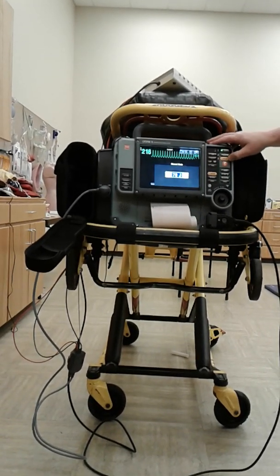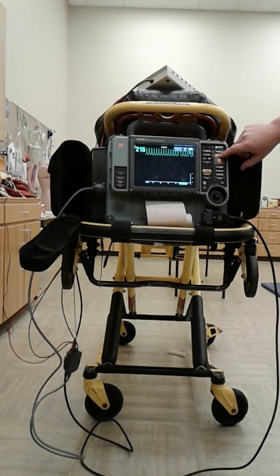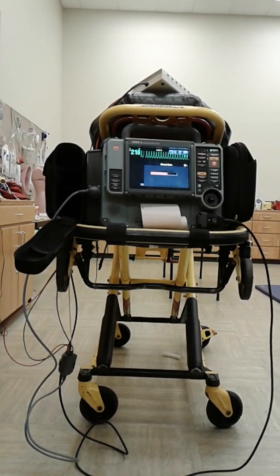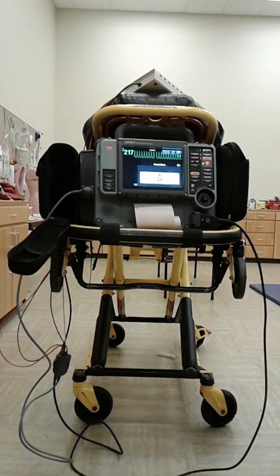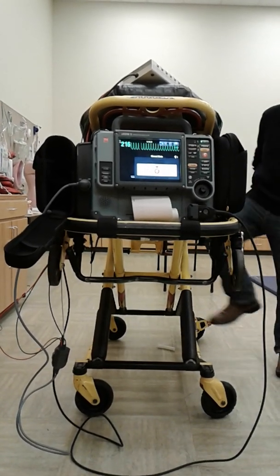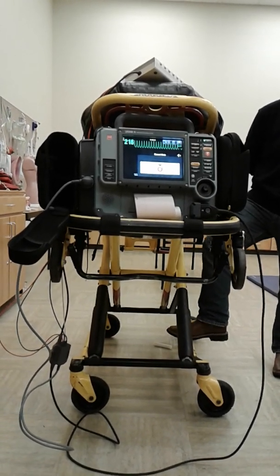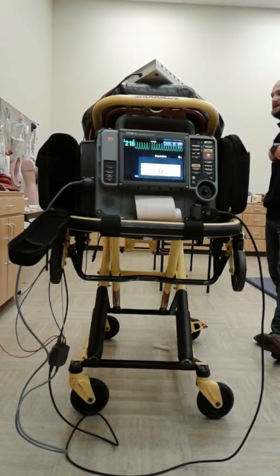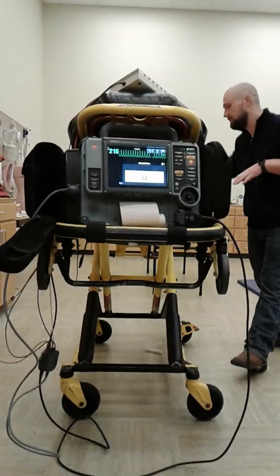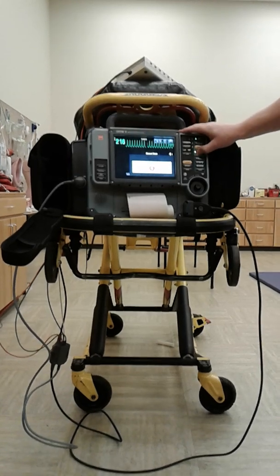All right, so that did work. So we'll juice them up there. We'll go to 100 with them. All right, charging. We are charging at 100. All right, you want to make sure your patient's clear, nothing's touching you, or you're not touching the patient, your partner's not touching the patient, you're not legged up on the stretcher like this right here. Same thing as when you defibrillate the patient. All right. I like to teach people, say, "I'm clear, you're clear, we're all clear." Sweep your patient real quick. So I'm clear, you're clear, we're all clear. Cardiovert, 1, 2, 3, press and hold.